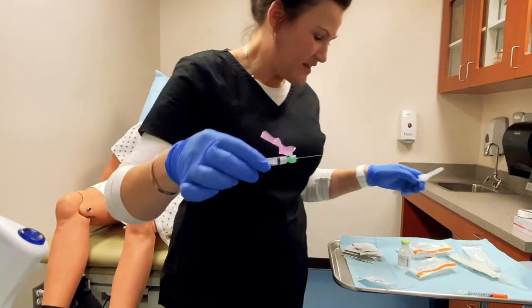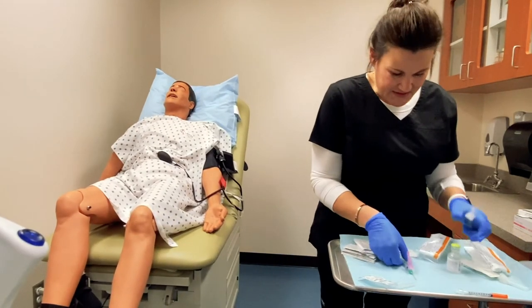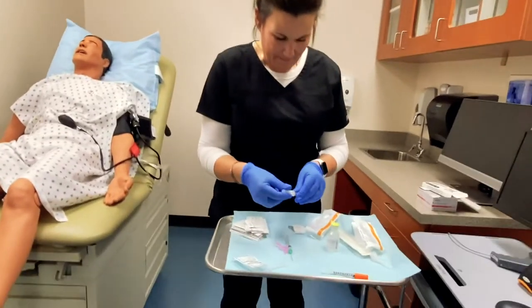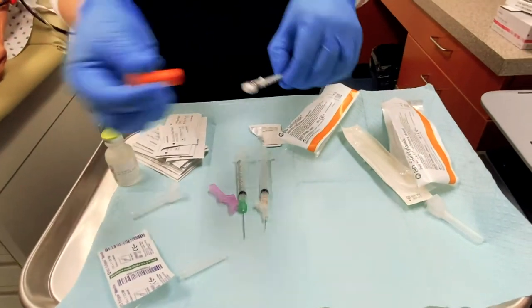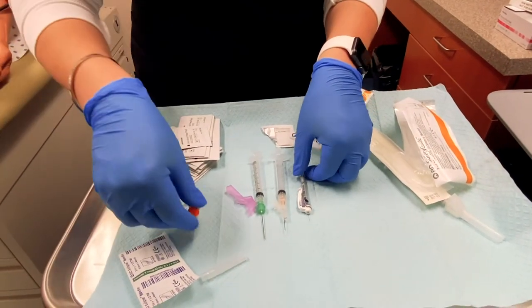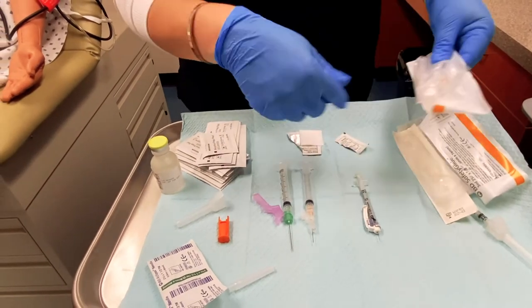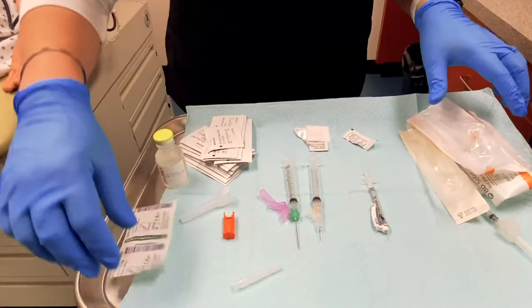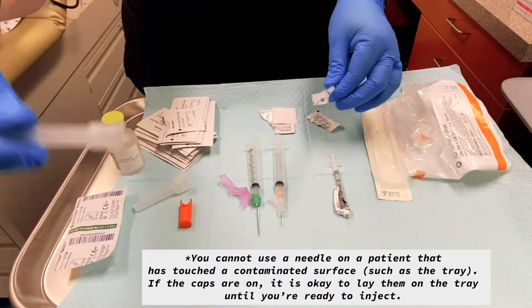I'm going to lay all these out so you can see the difference in size. Now that these have touched this chuck that we have here, I'm going to dispose of all of these — you can't use these on a patient.